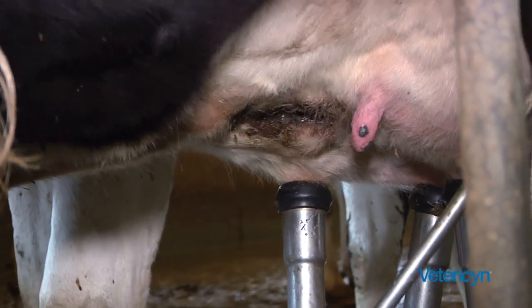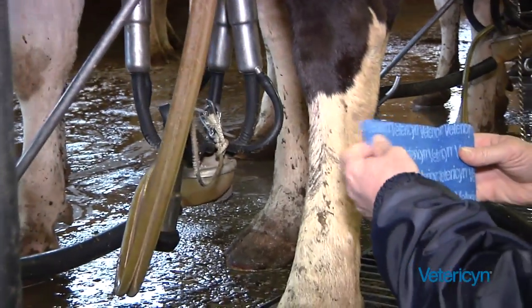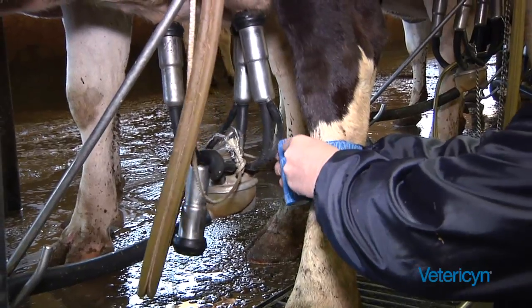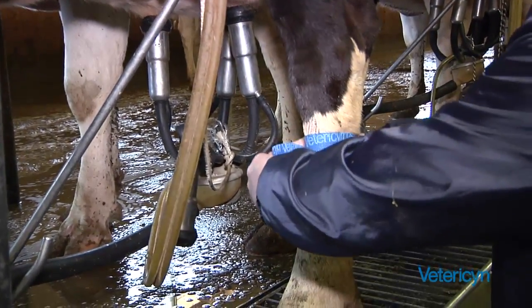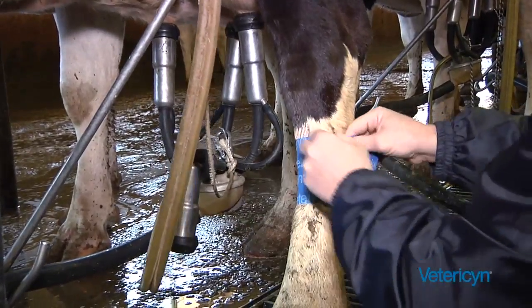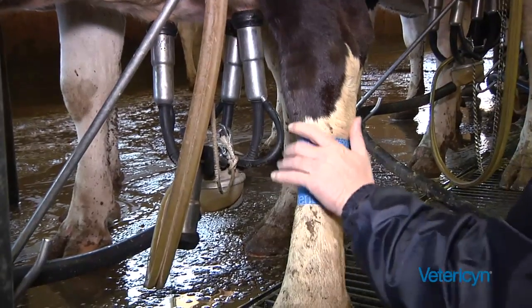I'm going to take the wrap and put it around the leg — as you can see it says Vetericyn right on it. A couple of wraps around the leg, and then just tear it with your fingers. Done.